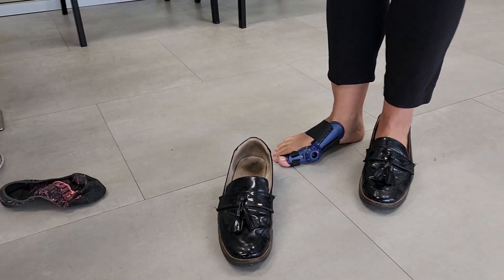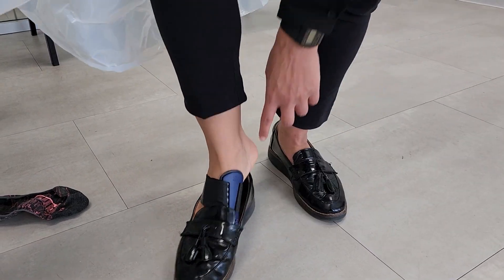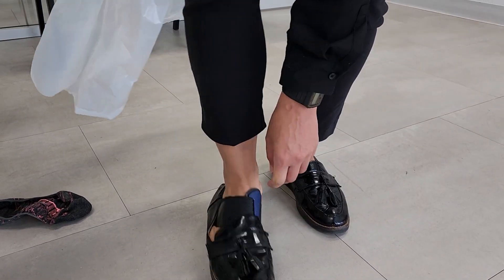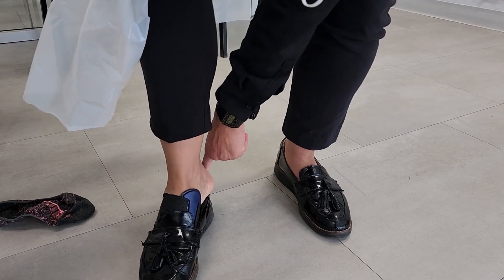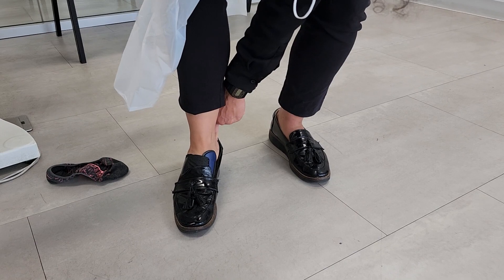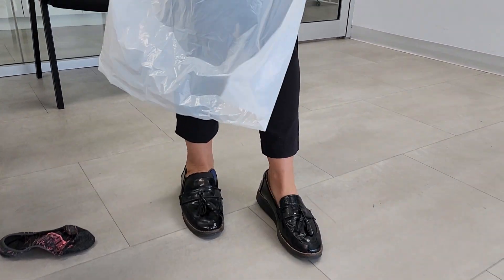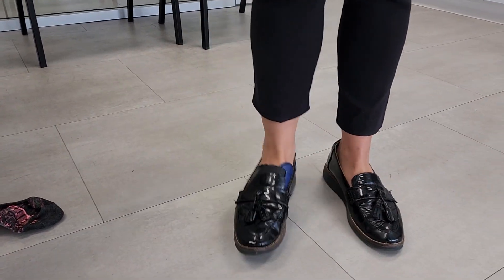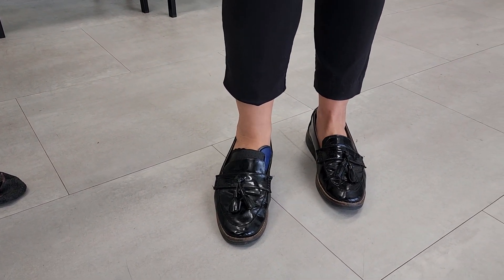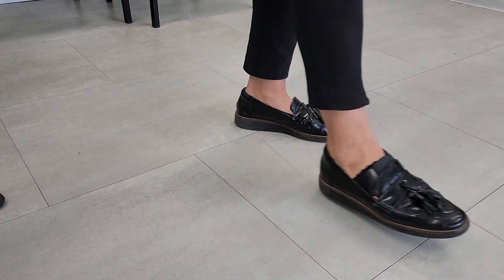So once again, with ligament injuries, soft tissue injuries, or joints with mild arthritis, we do tend to splint these joints. And this is really just like a big toe joint splint. How is it fitting into a shoe like that? I'm surprised it fit — it's made it tighter, but you can actually get it in. Yeah. So there's usually no problem in a jogger.